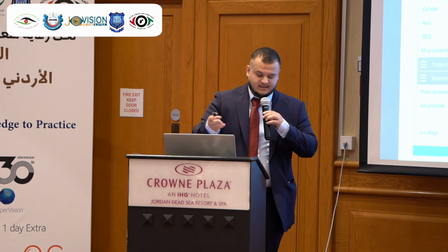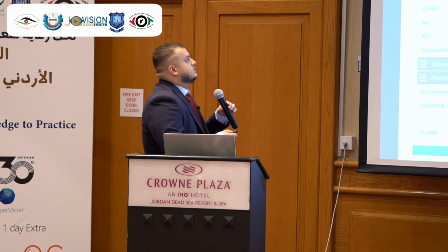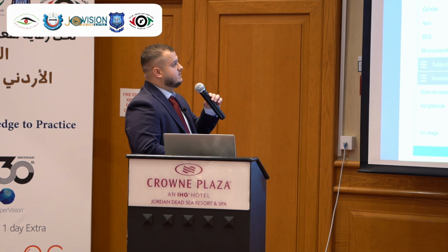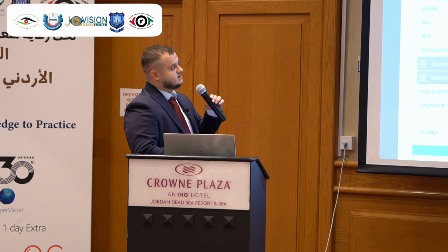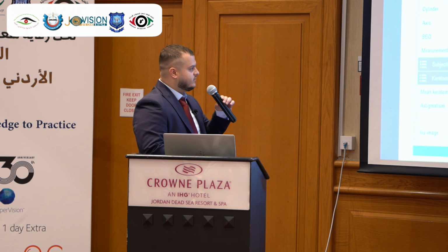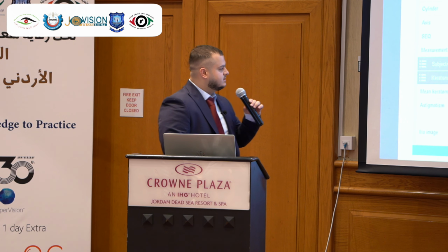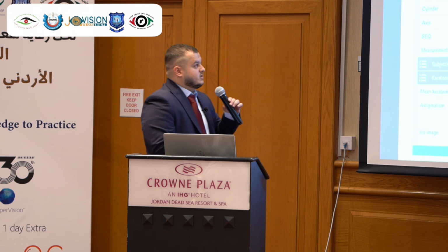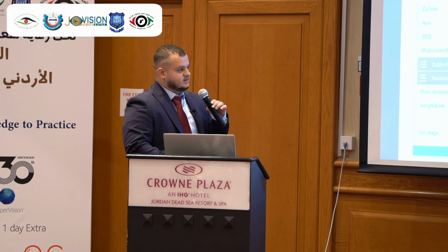Now we'll talk about the results. This is the data we measured from the myopia control device, before using Ortho-K. As we see here, axial length 23.78 and 23.68 millimeters at the OS, spherical equivalent minus 2.75 in both eyes, mean keratometric radius 7.60 and 7.50. The Brien Holden Vision Institute system gave us a calculation that the patient will be, at age 22 years, minus 5 diopters.